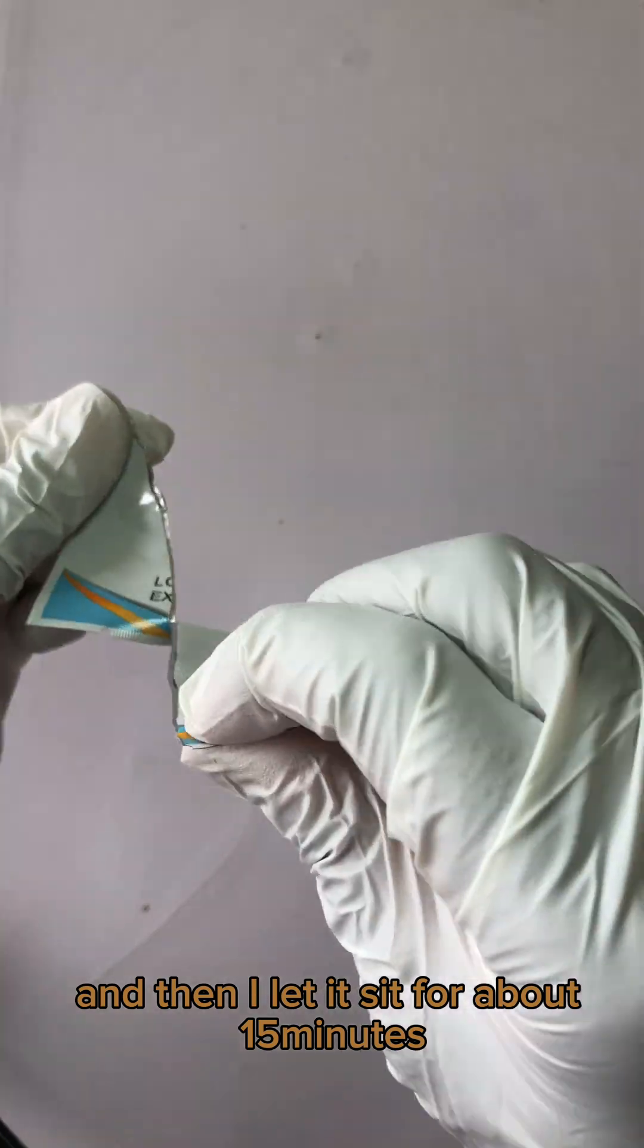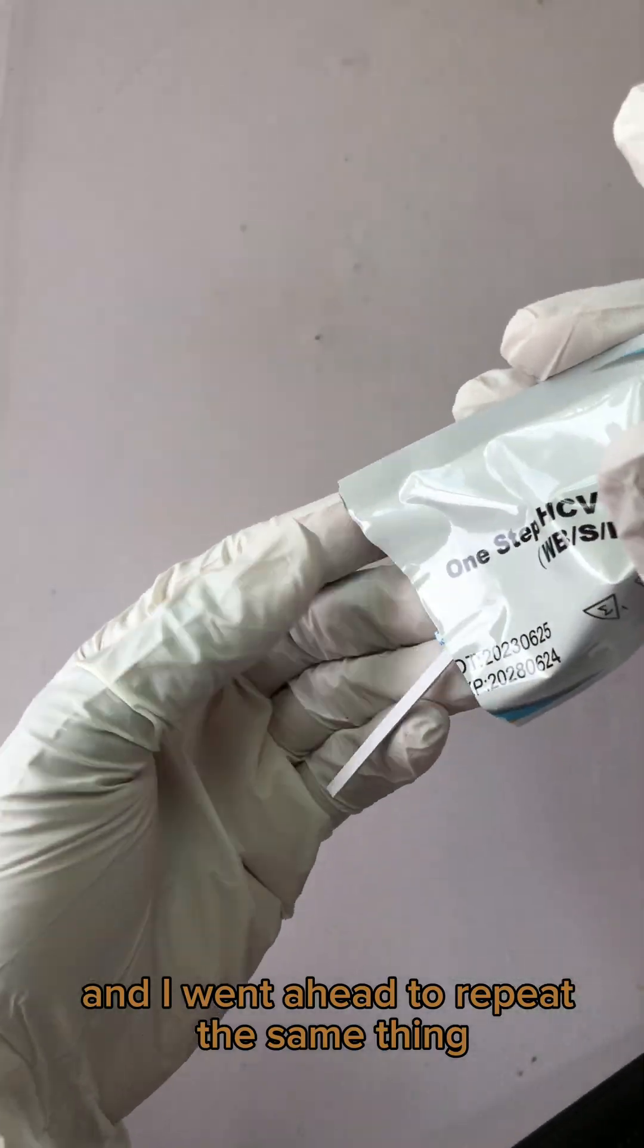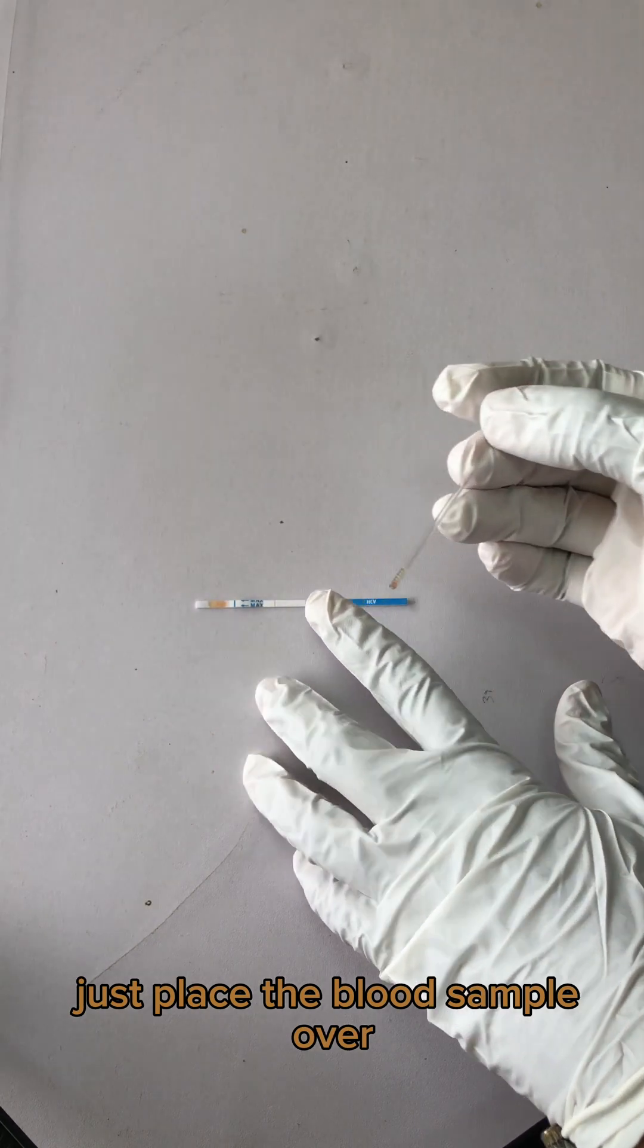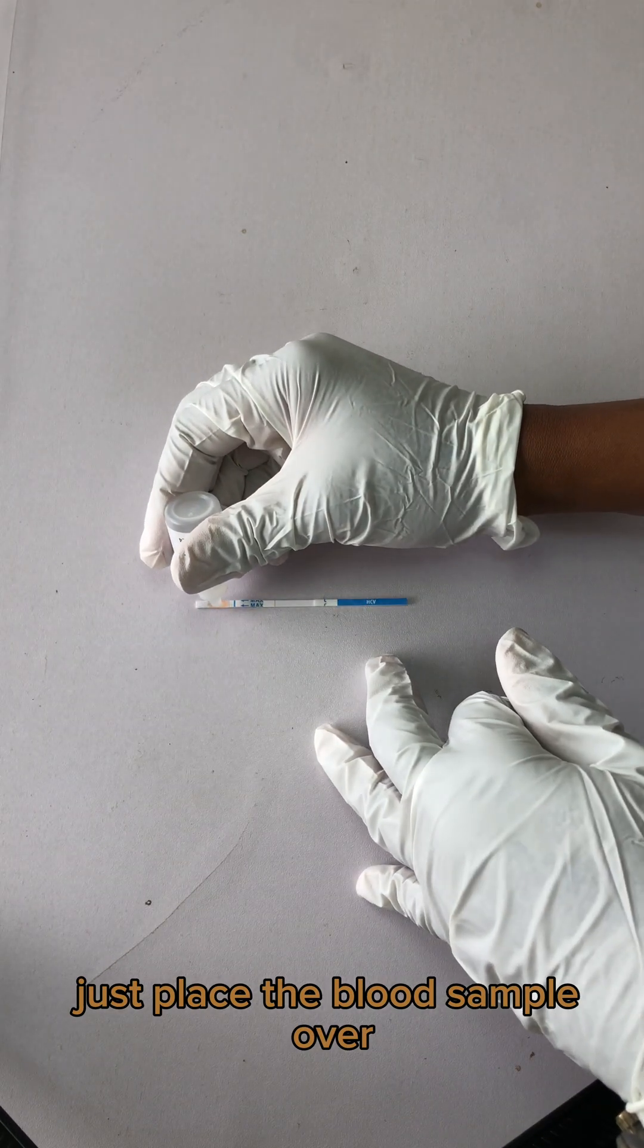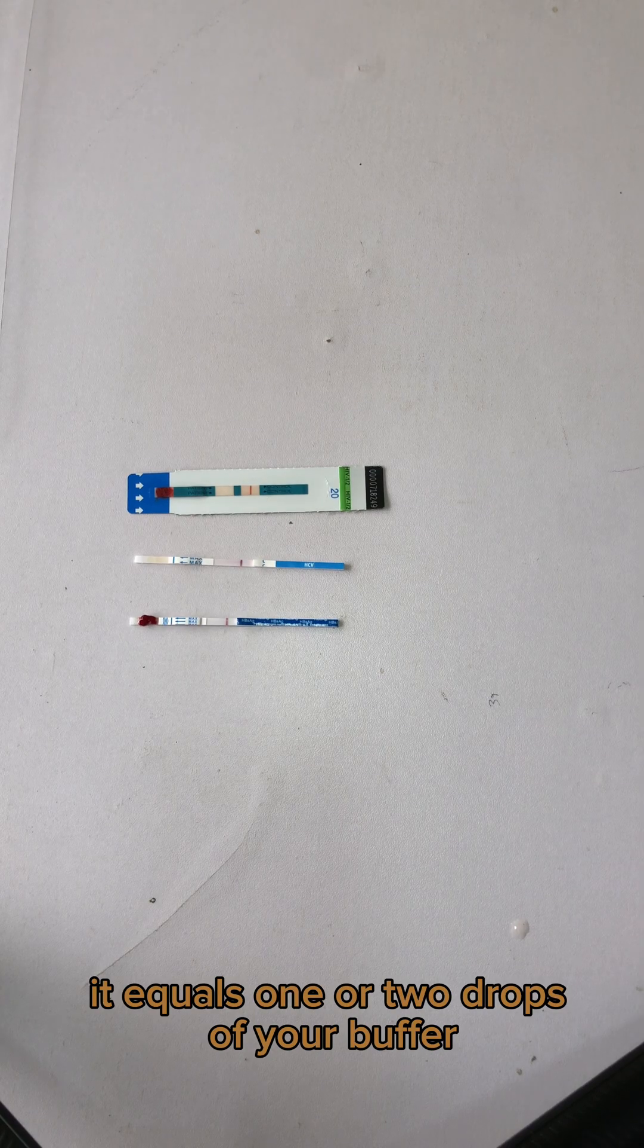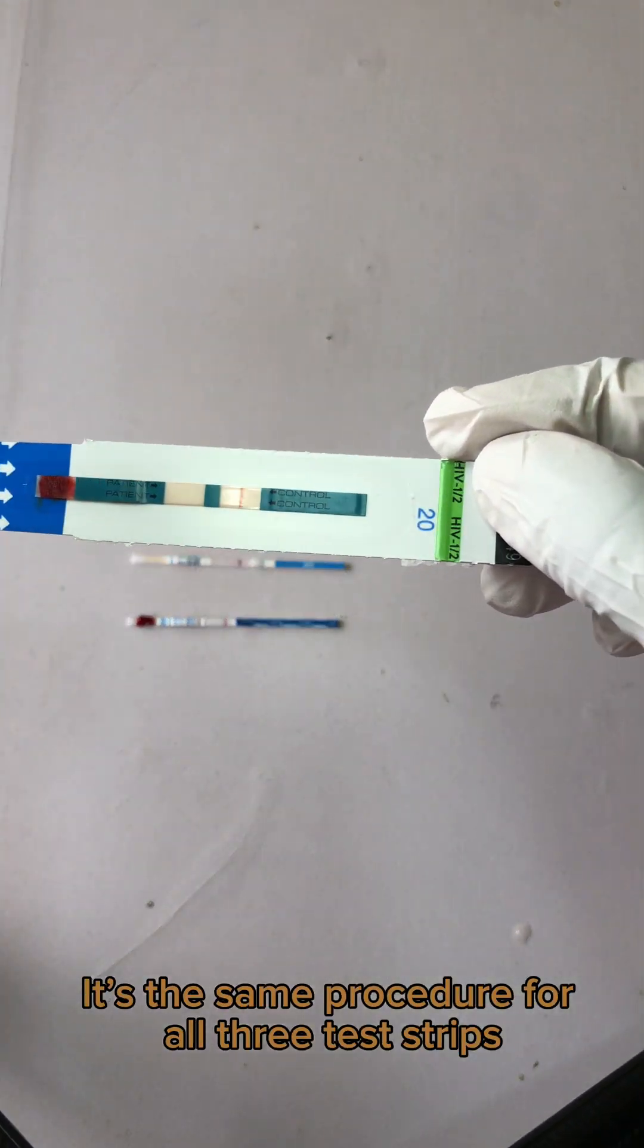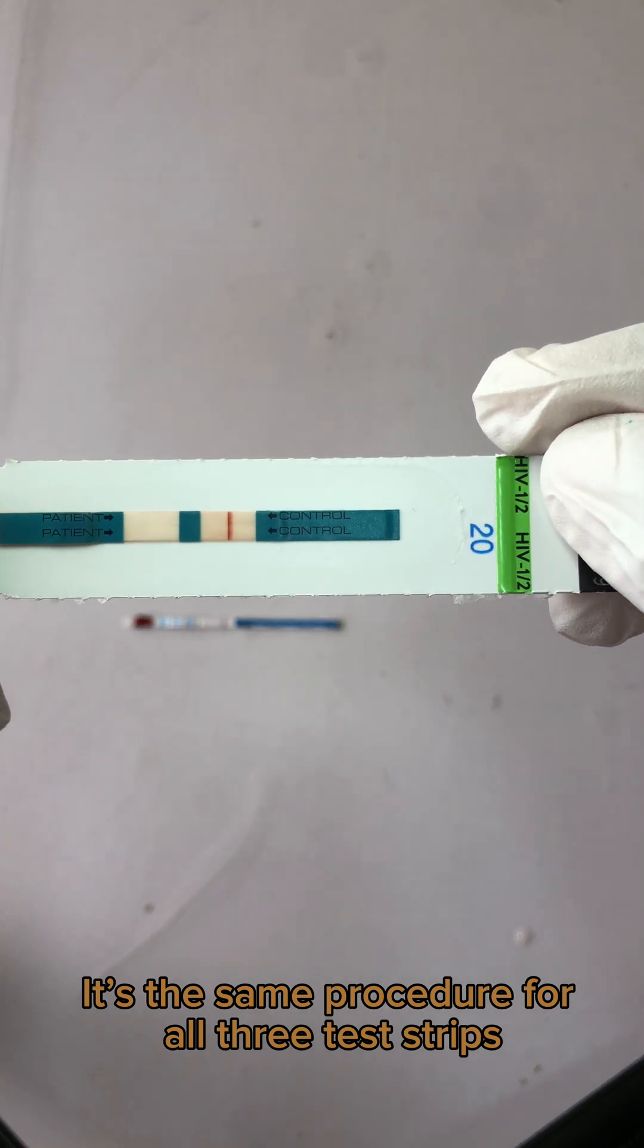And I went ahead to repeat the same thing on the Hepatitis C test strip. Just place the blood sample over it, you put one or two drops of your buffer, and then you watch it. It's the same procedure for all three test strips.